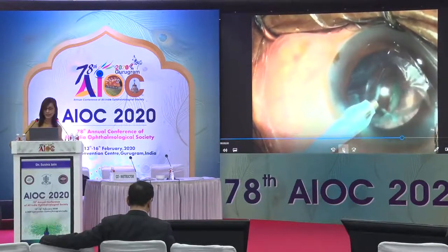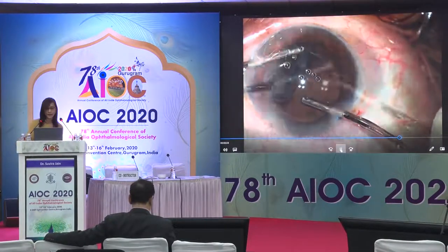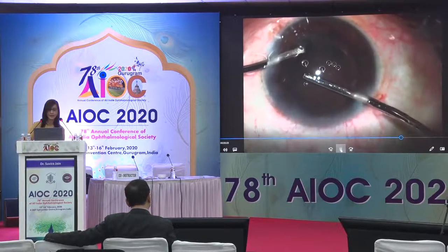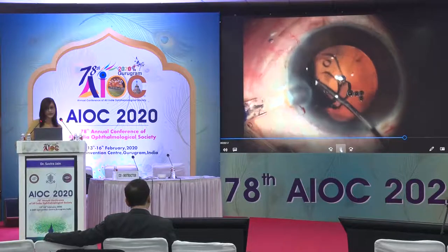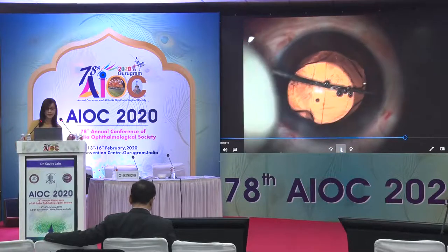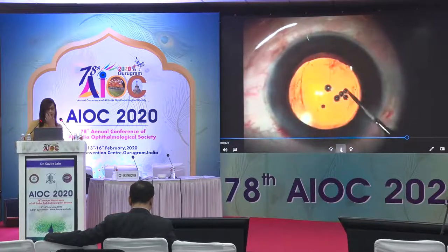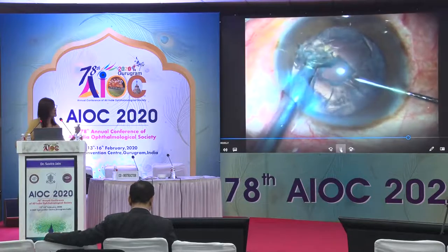On the other hand, when you actually see bowing or fish-mouthing, that signifies an open posterior capsule. In this second case, towards the second half of IA, the surgeon notices the typical elliptical equator-to-equator opening in the posterior capsule. Since there is no vitreous disturbance, the surgeon is able to carefully place a one-piece Zeiss lens in the confines of the bag after using a dispersive viscoelastic before the injection.